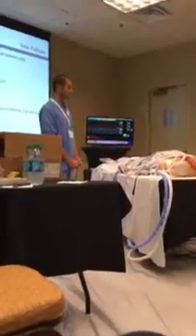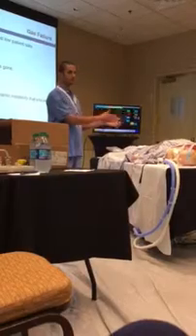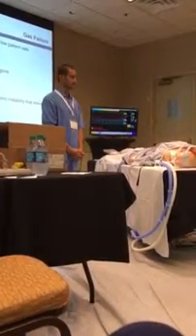Good. Yeah. I think that this case again highlights the importance of doing a full circuit check, including equipment, after transports. Bad things always happen.